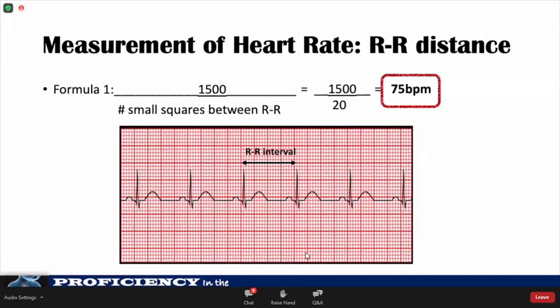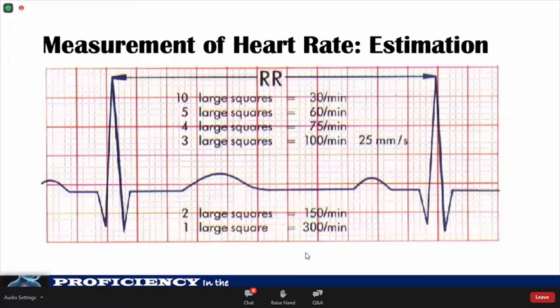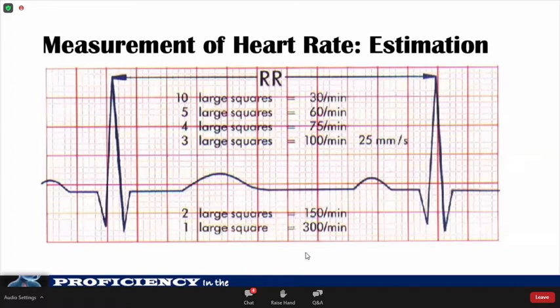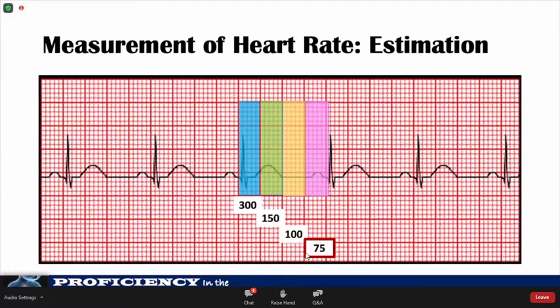Another way to measure heart rate is the estimation method. If you assume a QRS complex starts on a thick line and count off the large squares as 300, 150, 100, 75, etc., you can see where the next QRS complex lands and get a rough estimation of the heart rate. In this example, with four large squares between two consecutive R waves, the estimated rate is approximately 75 beats per minute. Note that this method only works if the rhythm is regular. Remember, heart rate in pediatric patients varies with age, so referral to normative data is essential.